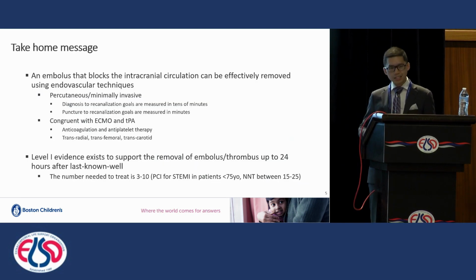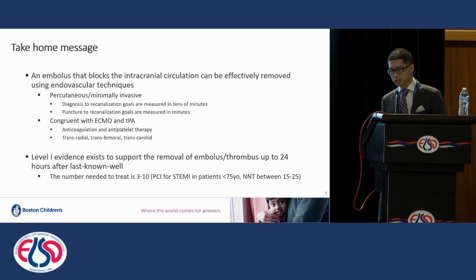So at the end of this conversation, I want to make sure that you have this core message. One is that if there is a thrombus or an embolus that blocks the intracranial circulation, we do have effective and well-proven techniques to treat this minimally invasively using endovascular strategies. And these are actually congruent with ECMO and also with TPA.